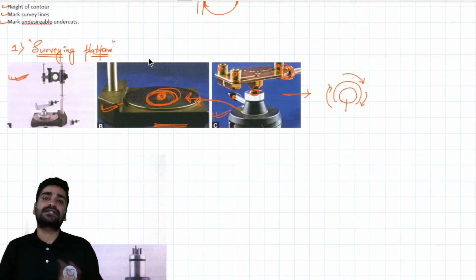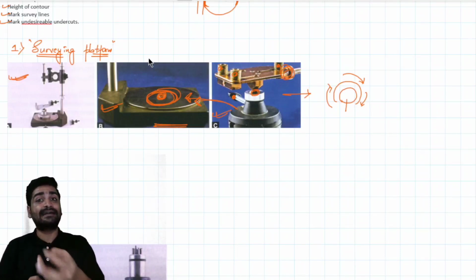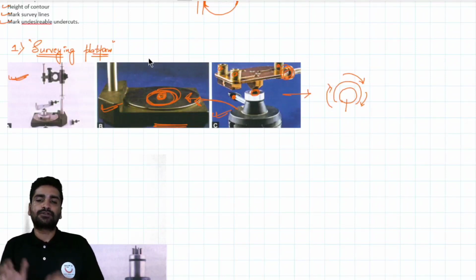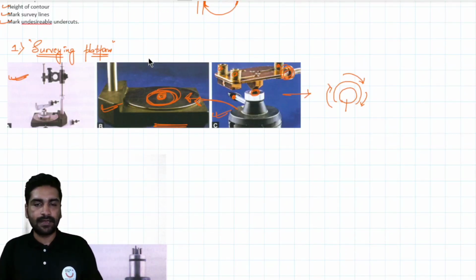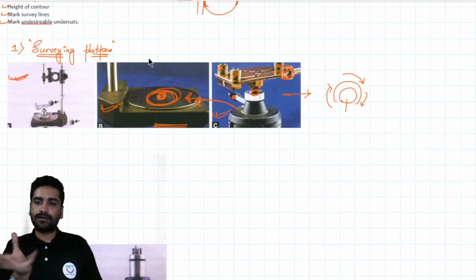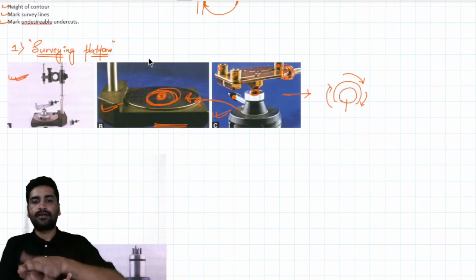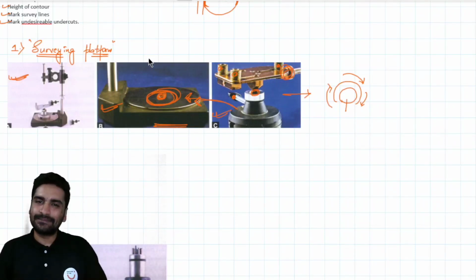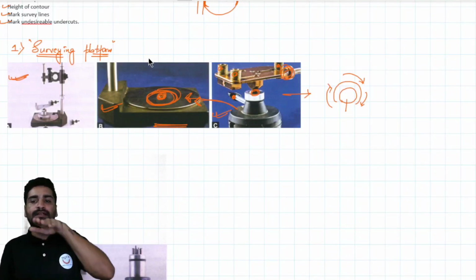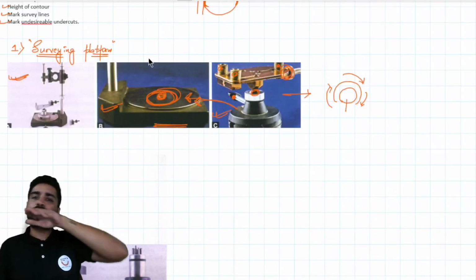Okay, you can watch various videos of how to practically do the process of surveying, right? But for that you need to understand all the terminologies that I'm going to discuss over here. When you understand all the terminologies and then watch the video of surveying, it's very useful. So, surveying platform and cast holder with a ball and socket joint where you can tilt. Maximum advisable tilt is how much? The maximum amount of tilt you can give in any direction. Tilt can be front, back, left or right.